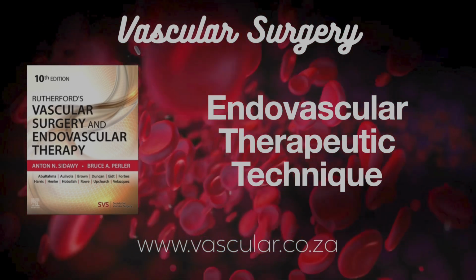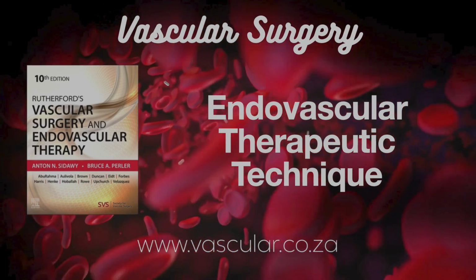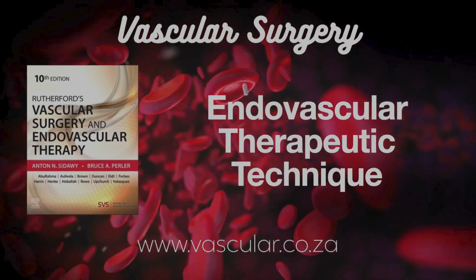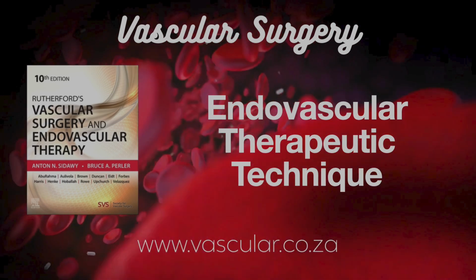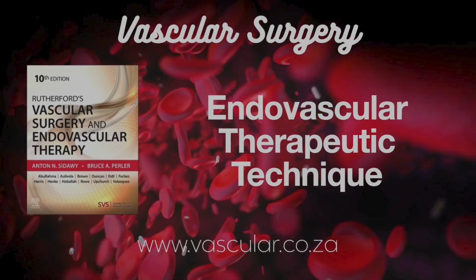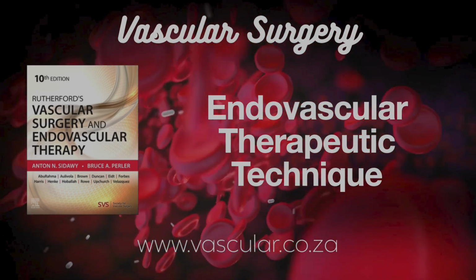Now, talking about the balloons themselves, it's not just one type fits all, right? The source mentioned different catheter types. Correct. For peripheral artery disease, we mainly see two types: over-the-wire, or OTW systems, and rapid exchange, or RX systems, sometimes called monorail. Okay, OTW first. What defines that system? With OTW, the guide wire runs through the entire length of the balloon catheter shaft.